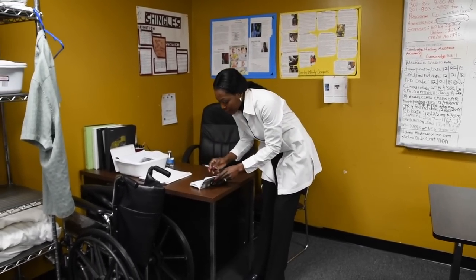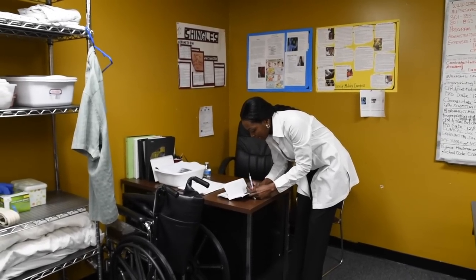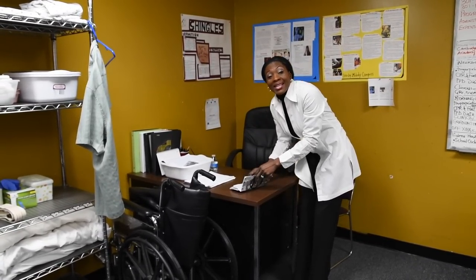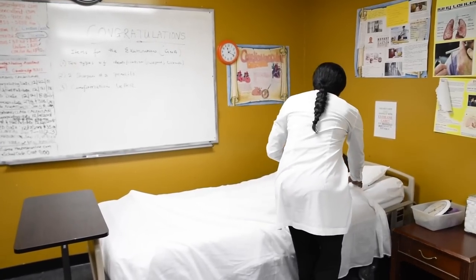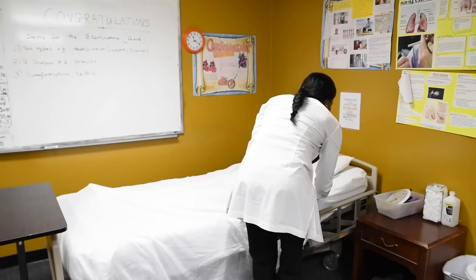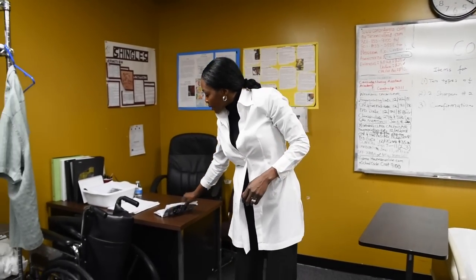Tell the examiner you are going to wash your hands before you record. It may seem like, how am I going to remember it? But unfortunately, we have to. So I tell the examiner I'm going to wash my hands, and underway, I would put how much I got. LBS with the number that you got. Miss Nafisa, this is your call light. The bed is in the lowest position. You are done with the scale. You go on to your next scale.